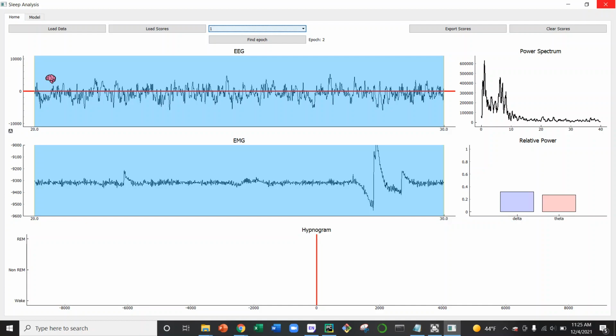The idea with the power spectrum is, can we take this complicated signal and separate it out into its component parts and see: is there a distinct component that is just this slower wave signal? Is there a component of the signal that's a faster wave signal? And is what we're looking at here really just a combination of those constituent frequencies? That is exactly what we're looking at with the power spectrum.